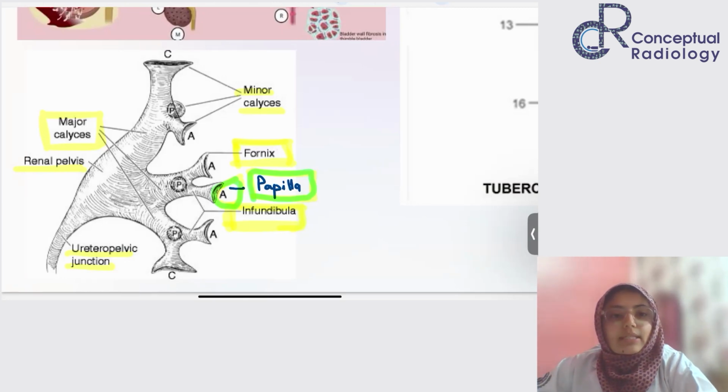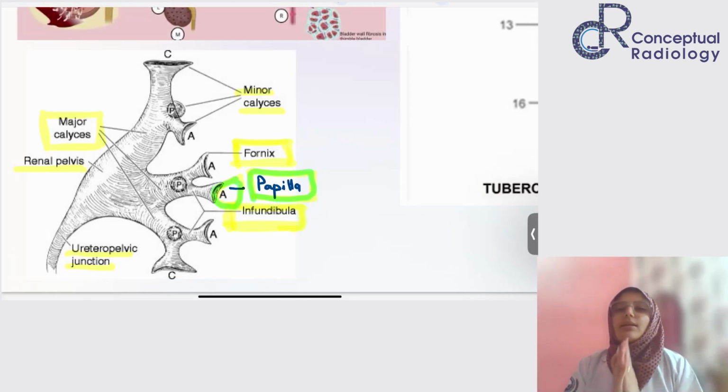We have just discussed that TB can involve various things, the genitourinary system, the adrenal glands, all of that is the immediate findings. And the diagram which we showed was from an RSNA article. Now we are discussing the microanatomy of the collecting system. Okay. So there is a term, papillary necrosis.